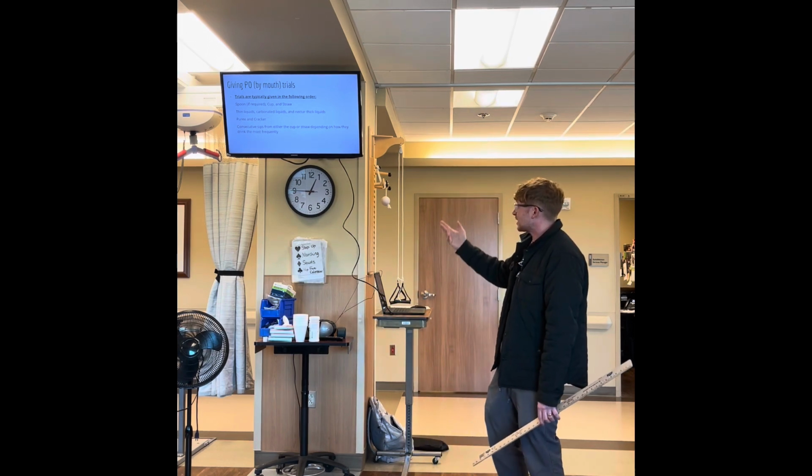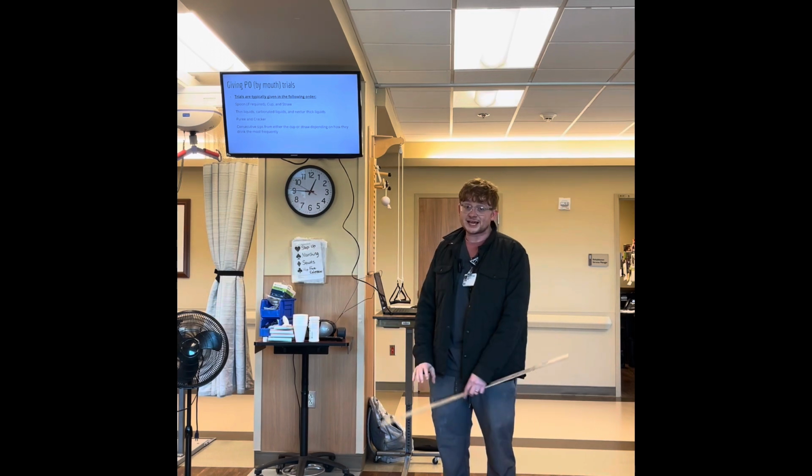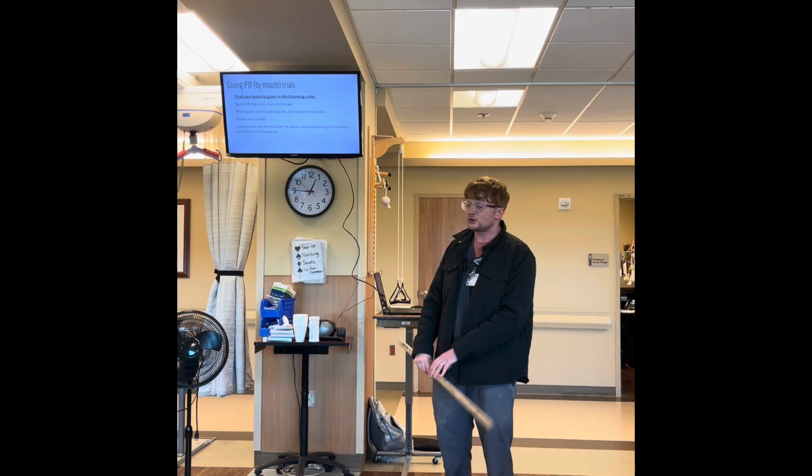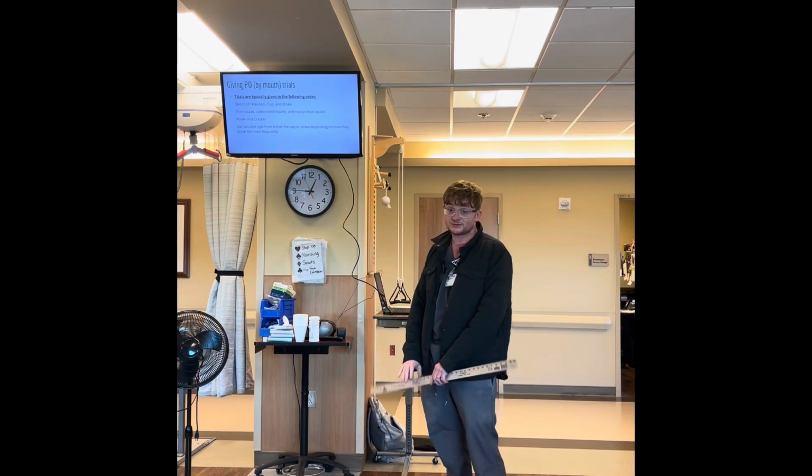And I say, hey, take a couple of drinks like you normally would. If they've aspirated during the test and it looks like it's going to be a problem, I usually would avoid that step, because I'm not trying to fill up their airway with more drink if I don't have to.